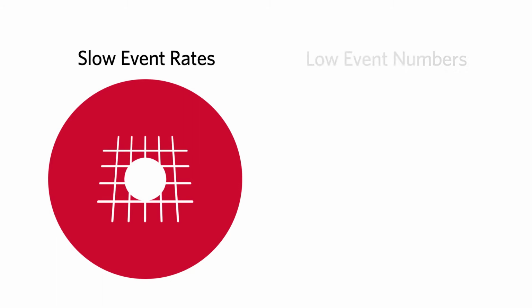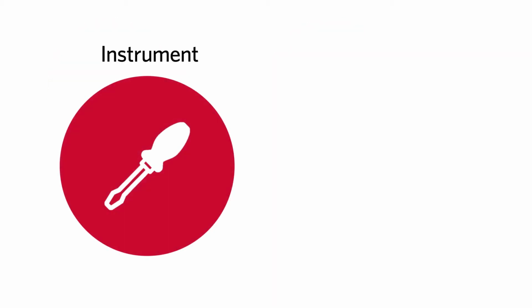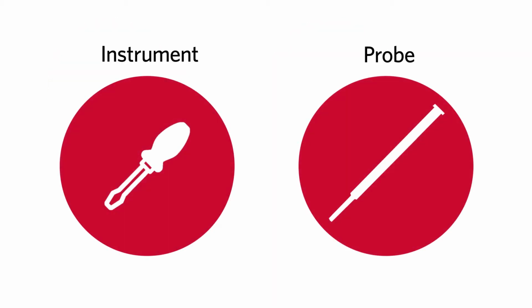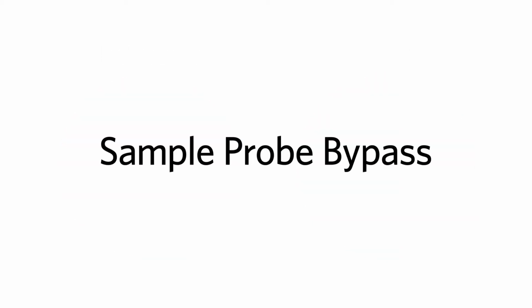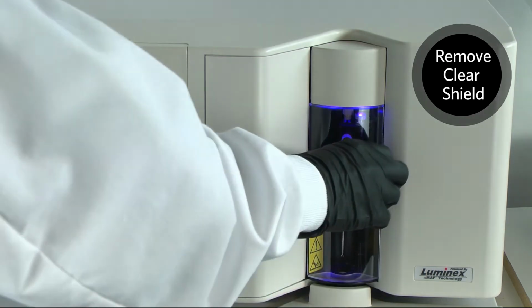Slow event rates or low event numbers can be due to a variety of issues. To determine if the issue is within the instrument versus probe-related, perform a sample probe bypass. First, remove the clear shield in front of the sample probe.